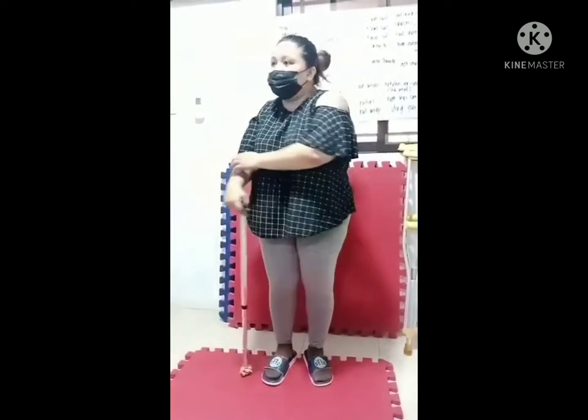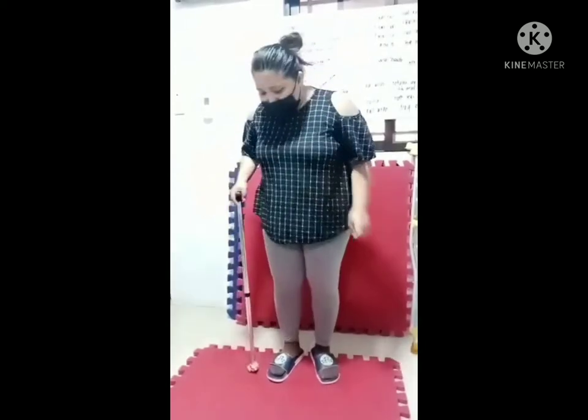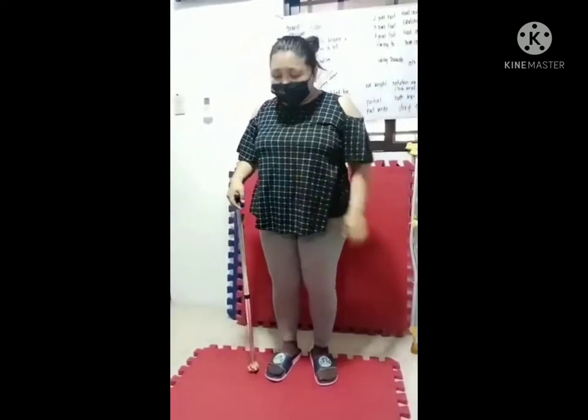Assist the patient into a standing position. Make sure that the handle is at the level of the hip line, and the elbow is at least 30 to 45 degrees angle. Make sure that you put a gait belt so that the patient won't fall or to avoid accidents, and assist the patient into the proper position.